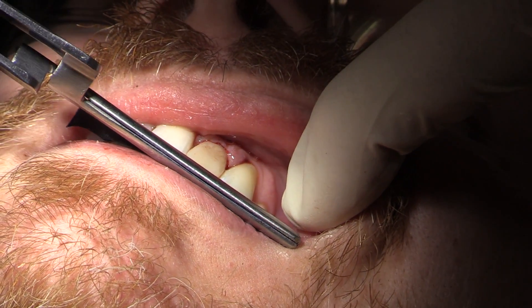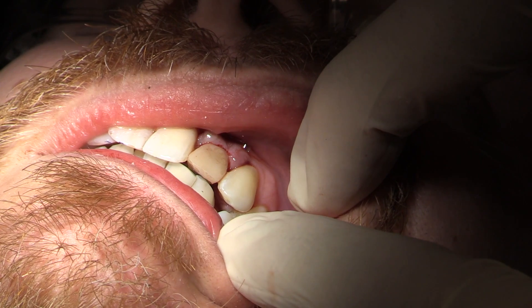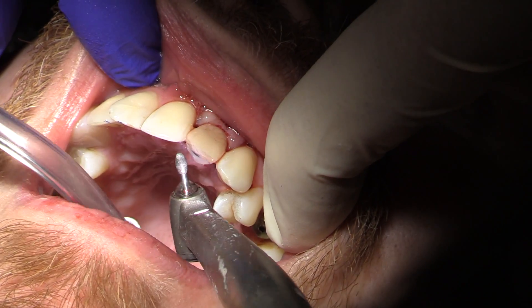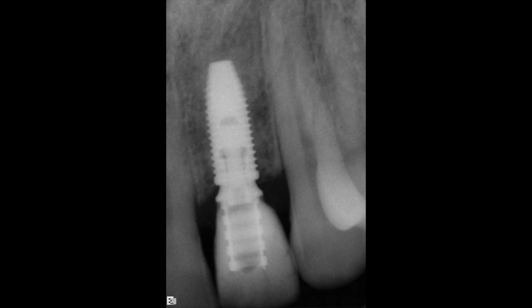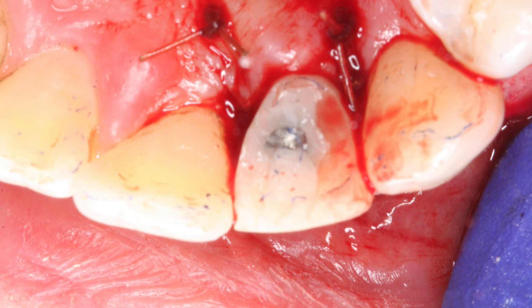Even if it's on the facial, you'll be able to do this. Our final task is to make sure this is a non-functional load — we'll take all protrusive, lateral working, and non-working interferences off of this temporary crown. You can see there's a little gap underneath now, so we want to make sure it's completely clear so that even if they bite really hard and push the teeth out a little bit, this tooth is not going to hit. We'll have the final tooth in better occlusion, but here we just want the bolus of food to be hitting this as the soft tissues are healing. It looks fantastic — we can see the temporaries in place, we have it sutured down, we'll let this heal and come back to make a final crown.